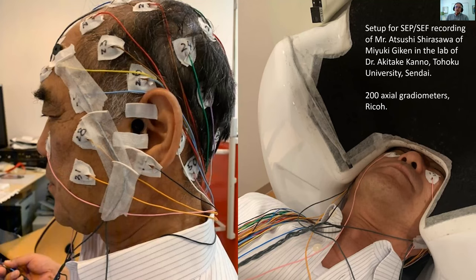So, for example, this system is an axial gradiometer. It's a gradiometer, so it's detecting differences out here. There are magnetometers, which don't perform the differencing operator out here. And they, in principle, can see deeper activity than the gradiometers can. EEG can see deeper activity.